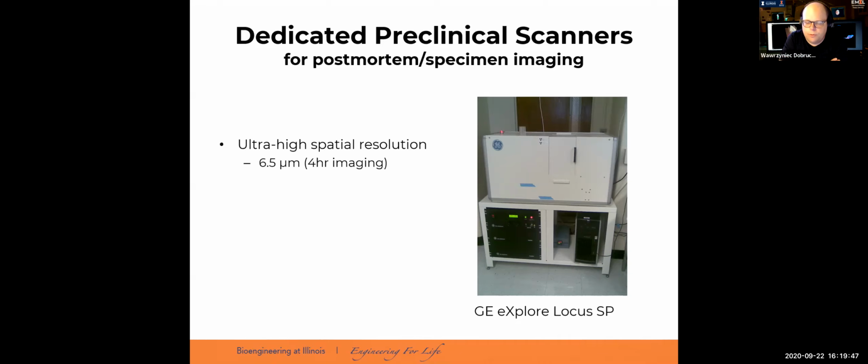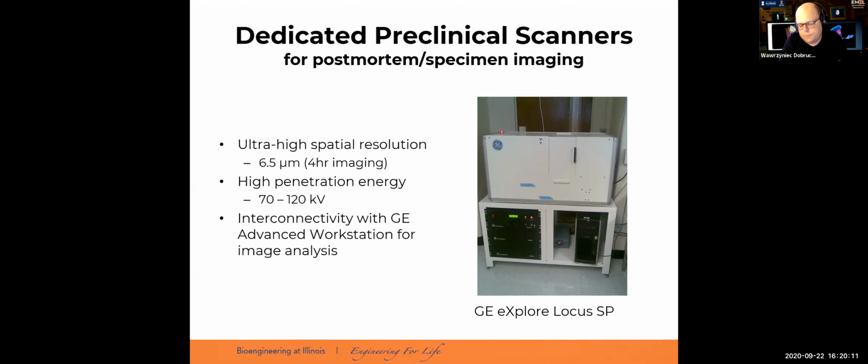Unfortunately, if you go lower with the resolution, going to very small specimens, it increases the acquisition time and, of course, the space on your disk. Just to acquire the images that I will show you in a moment, it took us 4 hours of imaging scan. So very long. The energy penetration was relatively high, same as in the previous example, and because it was also produced by GE Healthcare, there was interconnectivity with those advanced workstations.